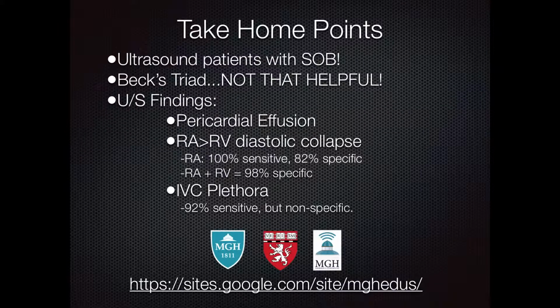The take-home points of this teaching case are to make sure to ultrasound every patient with shortness of breath. In this case, the chest x-ray was really not helpful, and his oxygen saturation was actually 100%. Beck's triad of muffled heart sounds, increased JVP, and hypotension are really not that helpful, but your ultrasound findings are much more sensitive and specific.